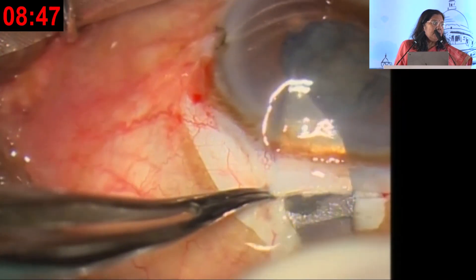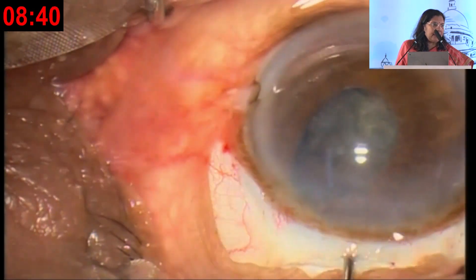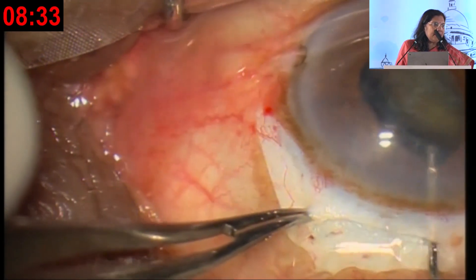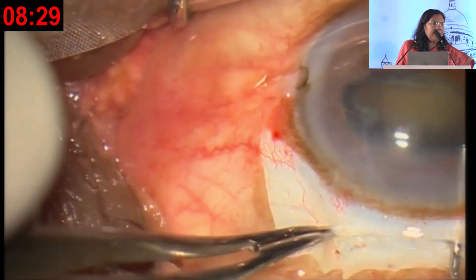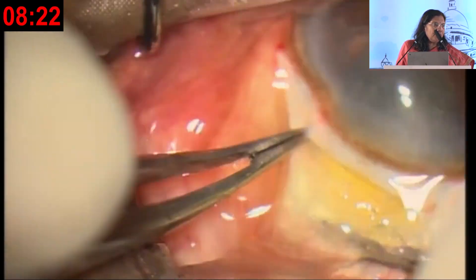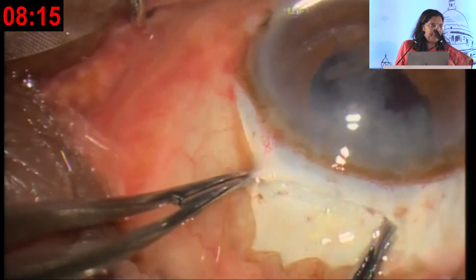As you can see, this is the Blumenthal technique — this is from Dr. Lane sir's video where he uses no viscoelastic. This is mobilizing the nucleus and bringing it anteriorly. Once the nucleus edge is seen and it is anterior, it is very easy. Rotating and then bringing it out of the pupil so that you are not doing any manipulations under the pupil.